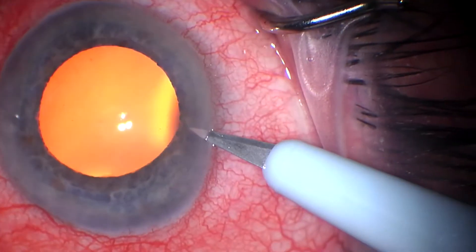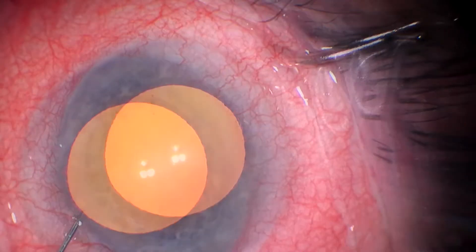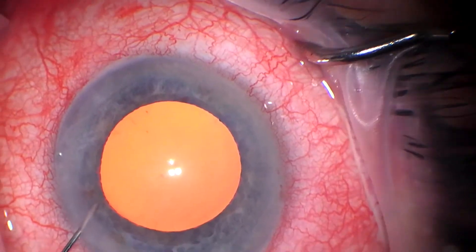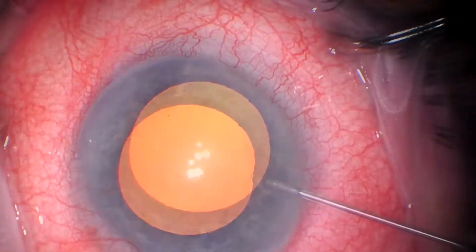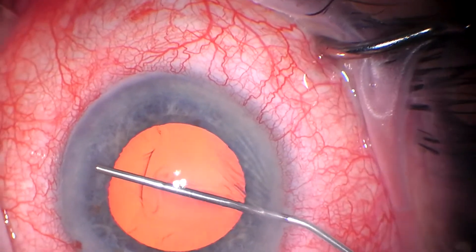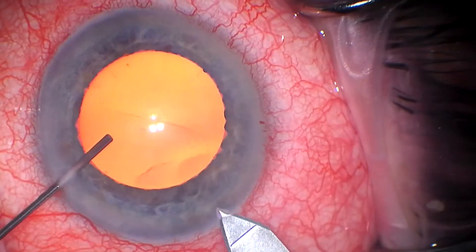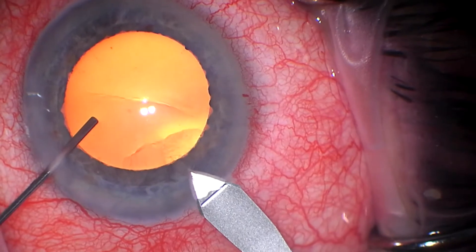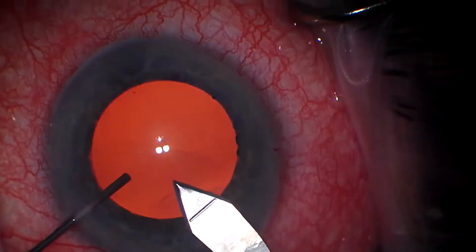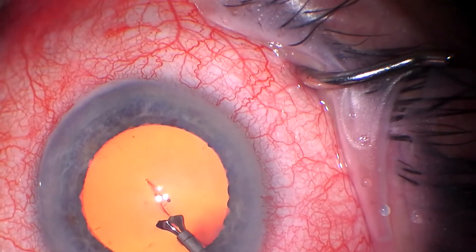I've been trying for some time to get a good video of a Hydrus procedure on my Alcon scope. It's an excellent Alcon Luxor LX3 scope, but it has some white balance issues with reflections off of metal. But I finally got what I felt like was a pretty good video and I thought I would share it.